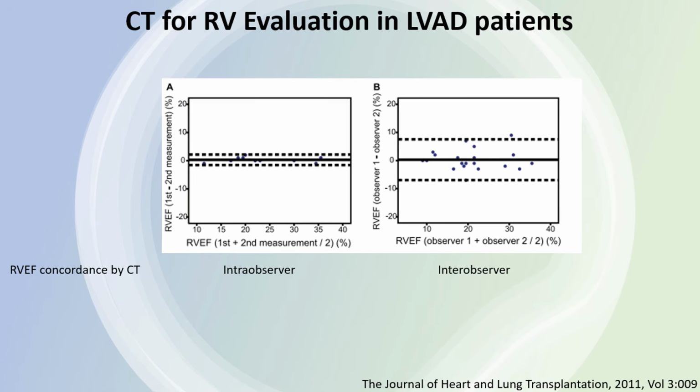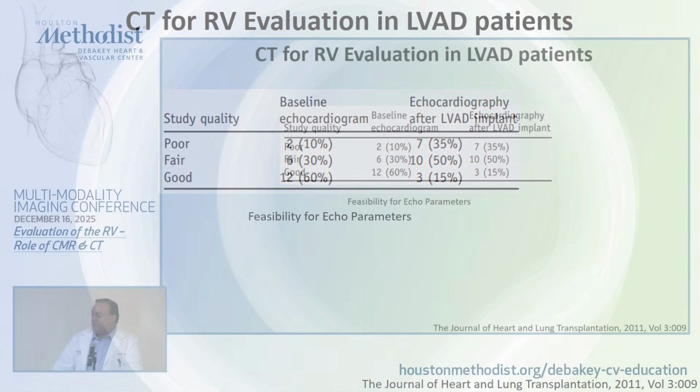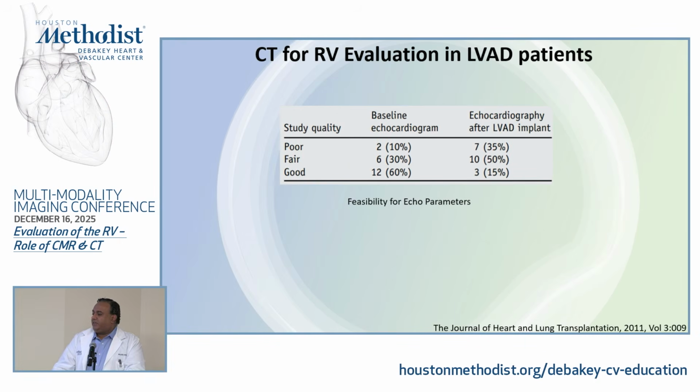So I'm going to skip this slide. So this is the challenge with echo. When they asked the readers to rate the study quality of baseline echo versus echo after LVAD implant, you can see 60% had good images at baseline, but only 15% have good images post LVAD, and that's just because of all the artifact.